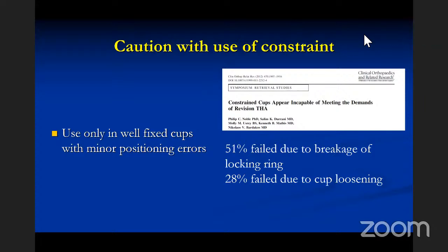What is the data on the wear characteristics of this poly in the dual mobility? Because you've got a large head against the poly, does it wear out more?